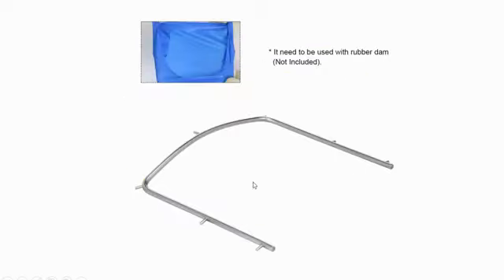And this is the most common which I like is the metal frame. ठीक है, तो मेटल फ्रेम भी होगा, उसमें भी ऐसे नॉचेस होंगे which help you attach. तो ऐसे करके आपका you can see how nicely the rubber dam sheet can attach. So these are the basic components which you need to know.